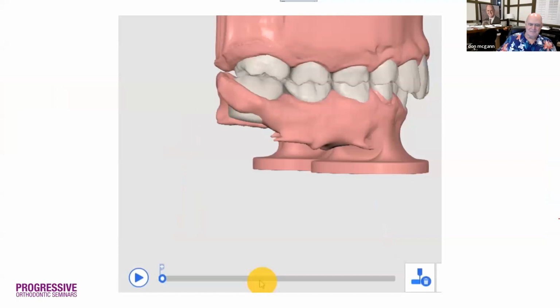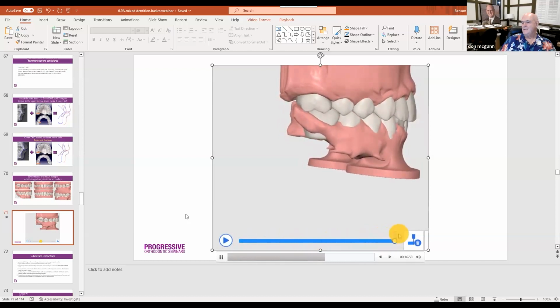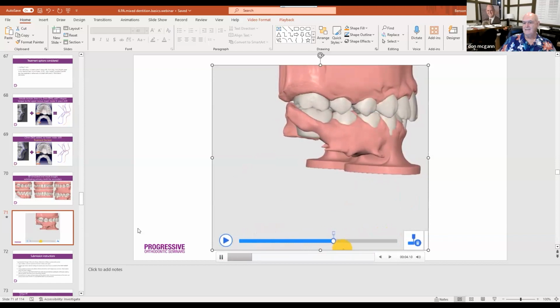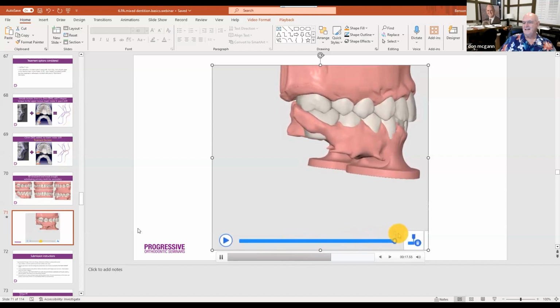Okay. All right. So let's see if we can see this. So do you see the substitution there? And then the change from like class 2 to class 1. I'll do that one more time, I think. Okay, you ready? You see some upper molar rotation? Just a little. You see the lower molar sliding forward? Yes.